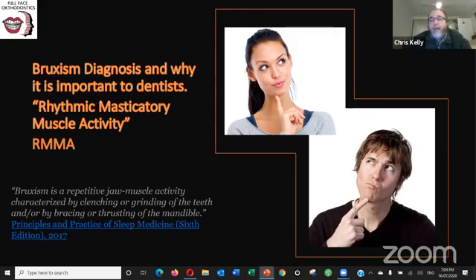Thanks, Derek. Well, hello, everybody. I'm hoping tonight we're going to give you some helpful tips on what kind of splints are suitable for what kind of patients. Throughout this lecture, there are some notes that allude to particular kinds of facial movement, bruxism style movement that's happening in a patient as detected by the sleep test that you can't see in a clinical observation. And that can actually give you a better indication of what kind of splint to use and actually when not to use certain kinds of splints.